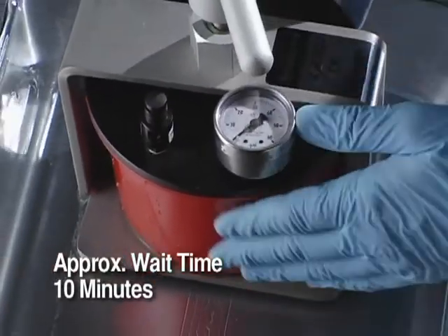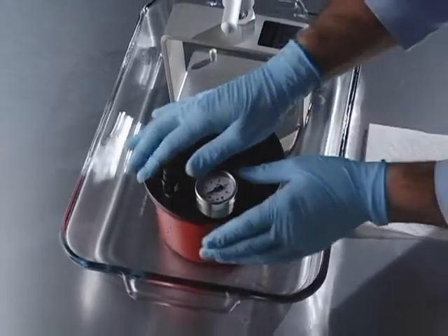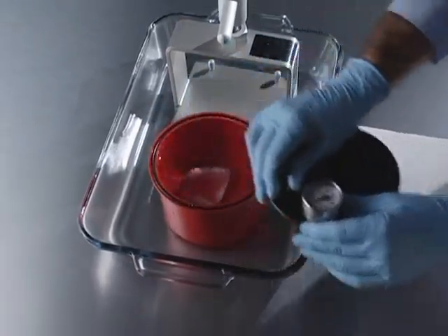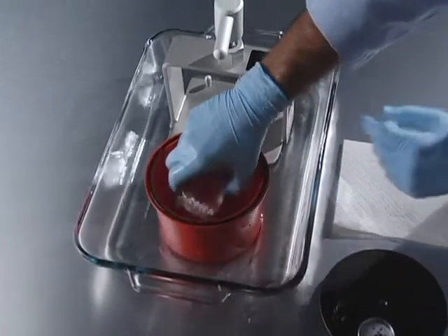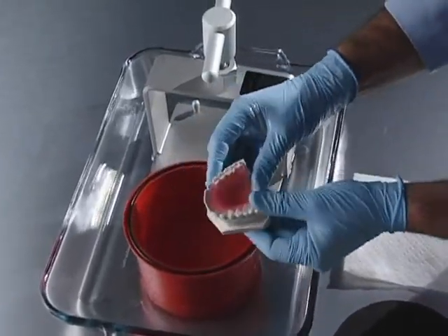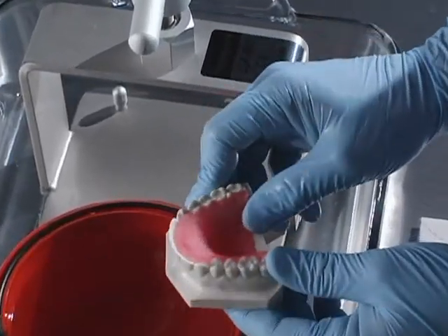After about 10 minutes, untighten the lid and slide the pot out. Release the pressure valve, then open the pot and remove the appliance. The retainer has cured without porosity. The AquaPress will work this well with all Lang and competitor self-curing resins.